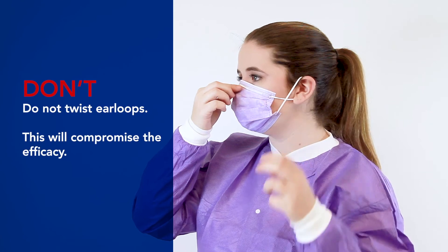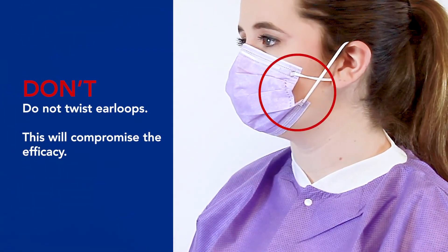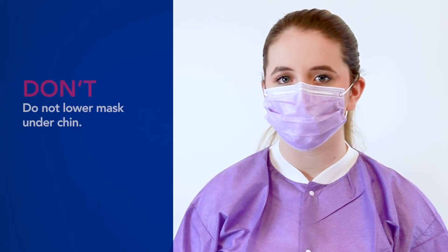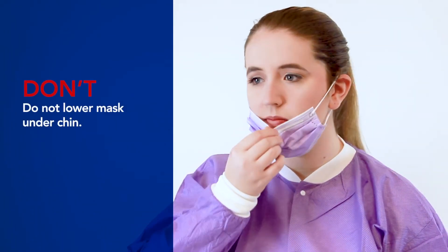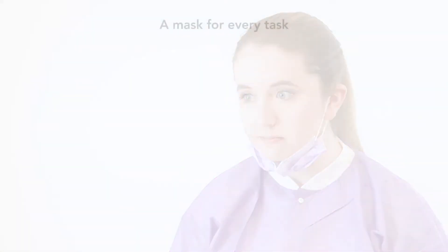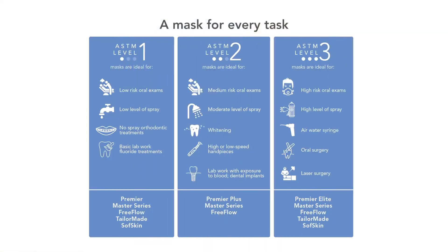Do not twist the ear loops — this will compromise the efficacy of the mask. For maximum efficacy, do not lower the mask under your chin. The Medicom Safe Mask: a mask for every task.